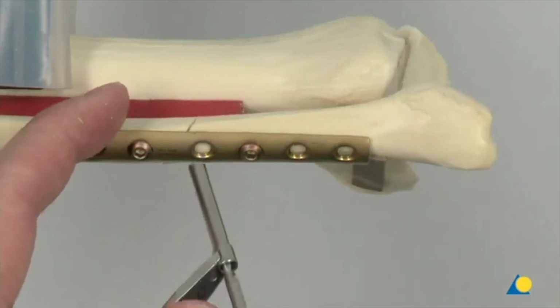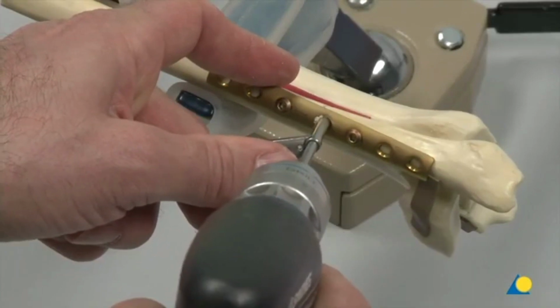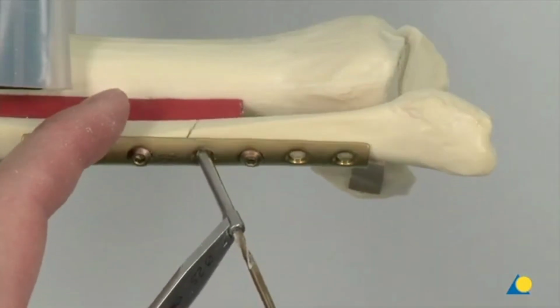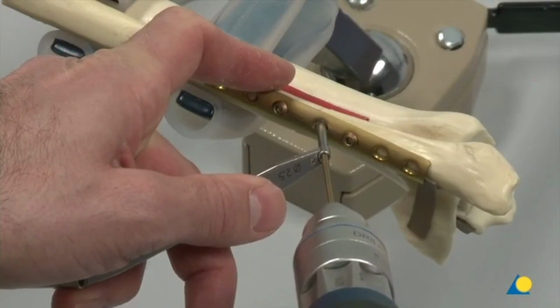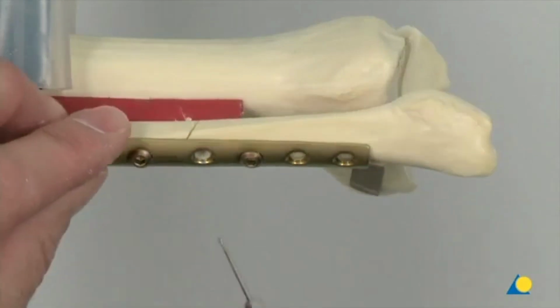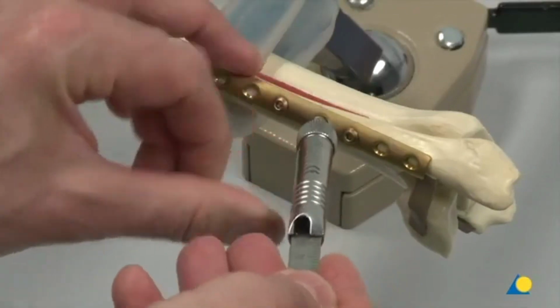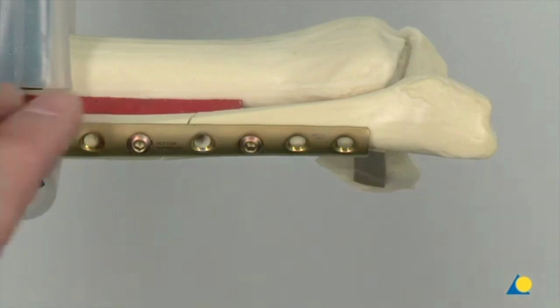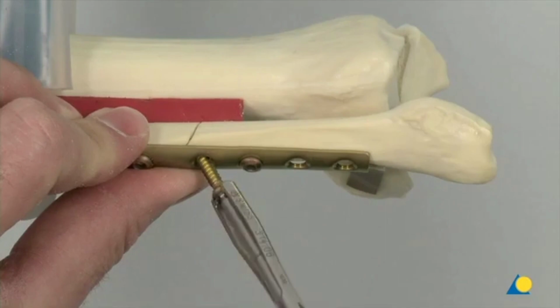The glide hole is drilled for lag screw insertion using the 3.5 mm drill bit and drill guide through the near cortex only. A thread hole is drilled through the opposite cortex using the 2.5 mm drill bit and drill guide. The required length of screw is measured using the depth gauge. The 3.5 mm self-tapping screw is inserted, functioning as a lag screw.